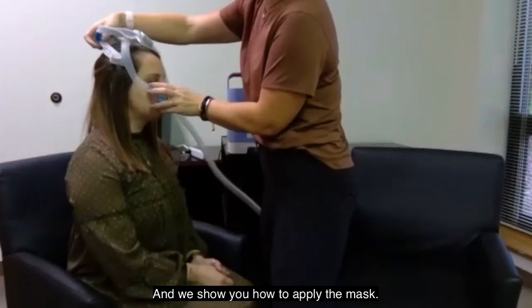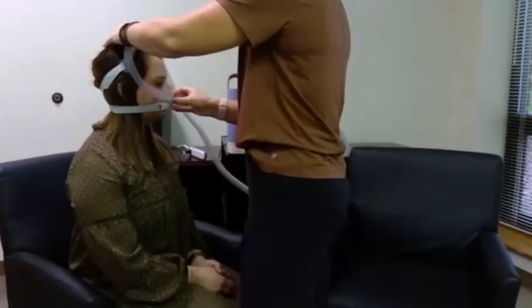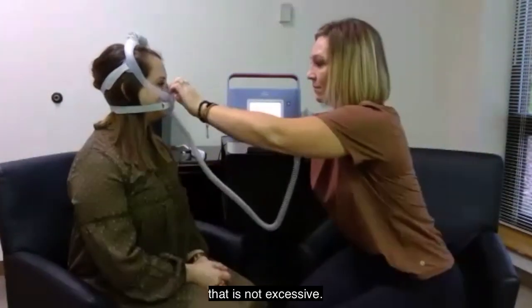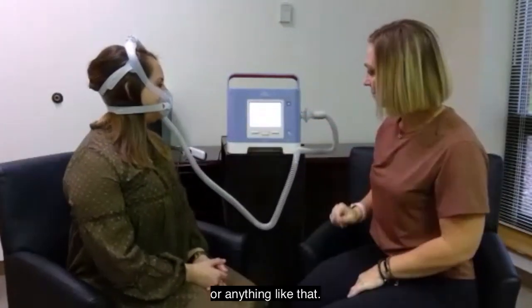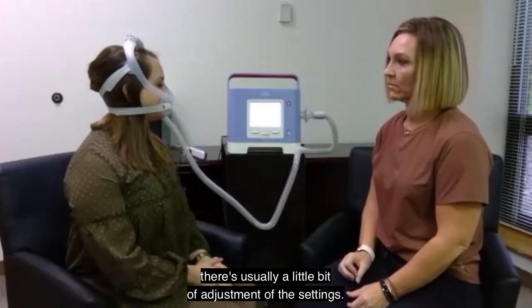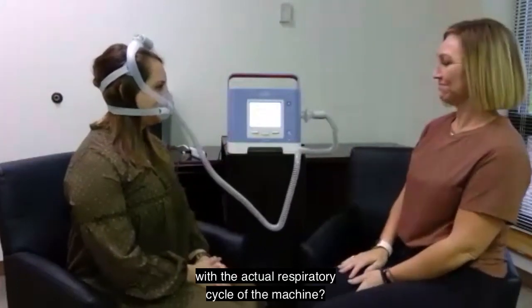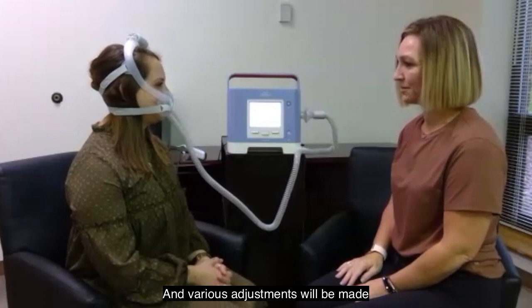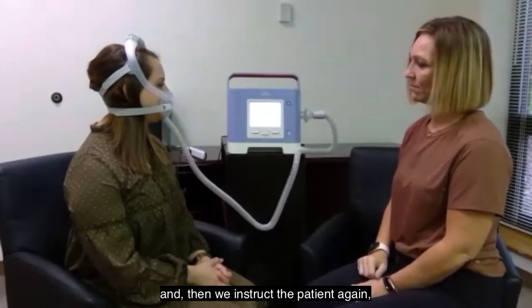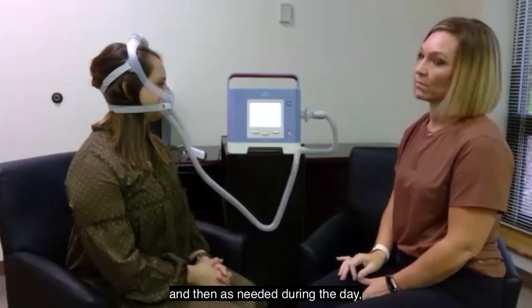We show you how to apply the mask. The point we're trying to emphasize is we want it to be as comfortable as possible for the wearer — not too tight, but not too loose, so that we have an adequate seal without excessive leak. We want to make sure it's not blowing in your eyes. Once we turn the device on, there's usually a little bit of adjustment of the settings. The therapist will communicate with the patient to find out if it's flowing too fast or too slow, and whether they feel comfortable with the respiratory cycle. Various adjustments will be made, and we instruct the patient how and when to use it. The goal is typically to wear your Trilogy at night while sleeping, and then as needed during the day.